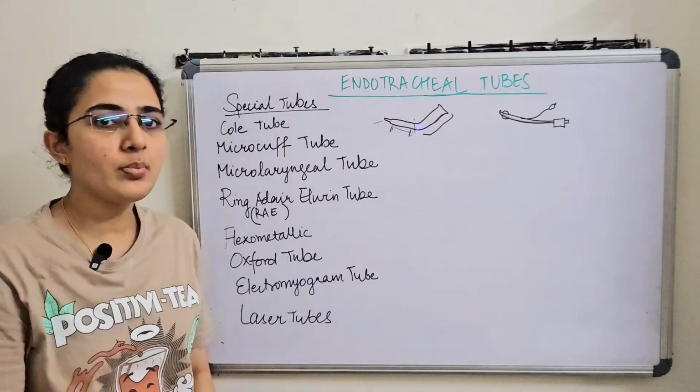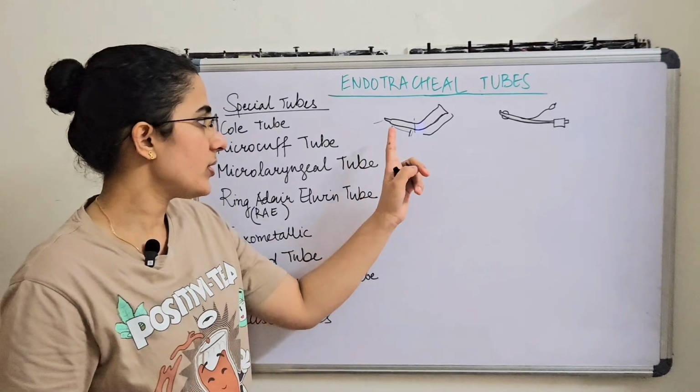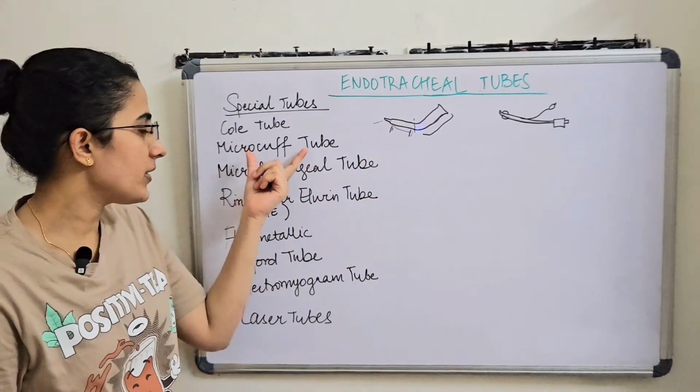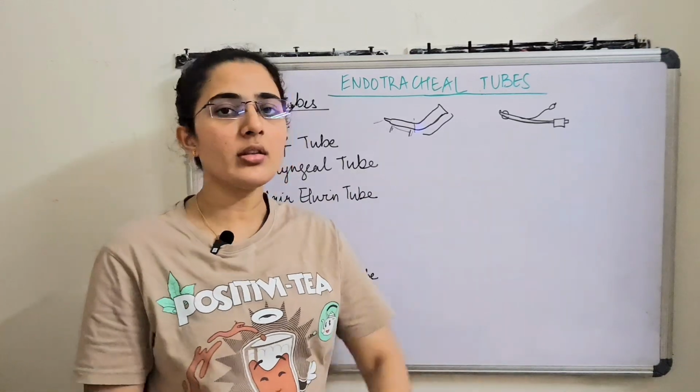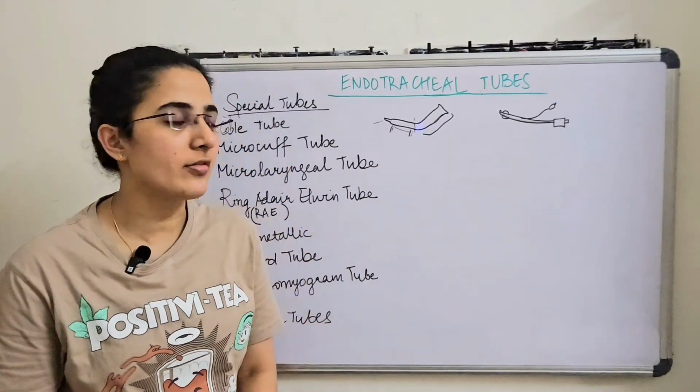If we try to further push inwards, it will cause a lot of trauma. So this is one of the salient features of the Cole's tube. Next, we have the microcuff tube. The microcuff tube is also basically designed for the pediatric age group itself.